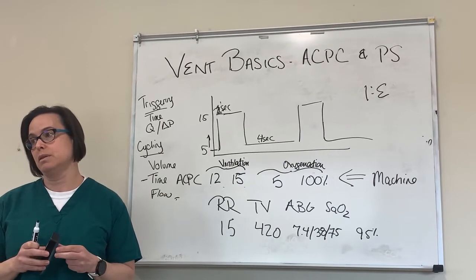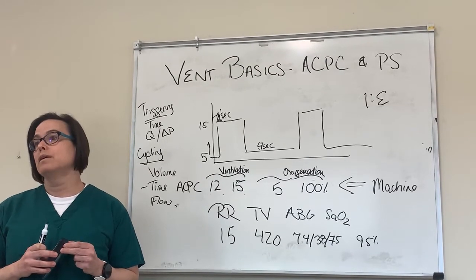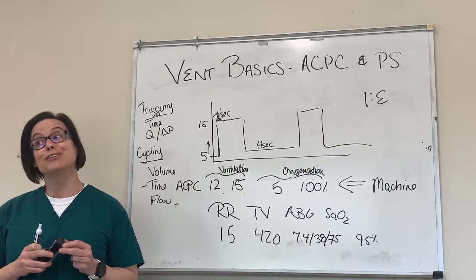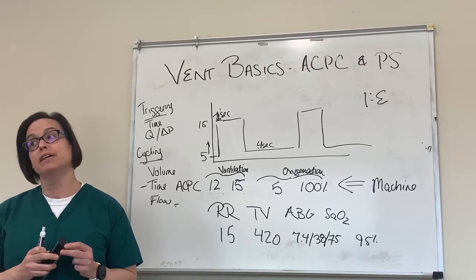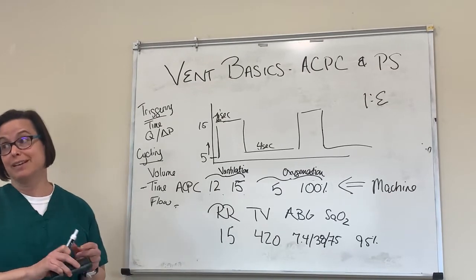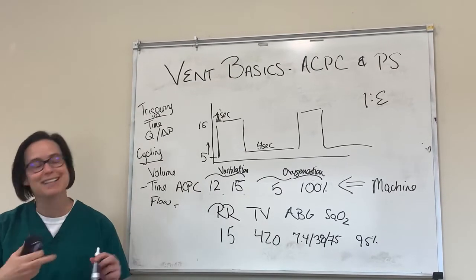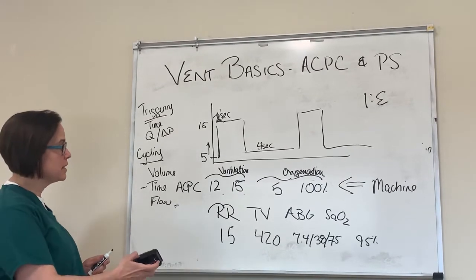So that way you can kind of see what tidal volume each patient is actually taking in? Correct. We're still not going to know that exactly. We're just going to know that they're safer. We still have one ventilator, so we can't measure that specifically for each individual. Yeah, it hurts me inside to think about it too, but if we're at that stage, we're at that stage. So something to keep in mind.